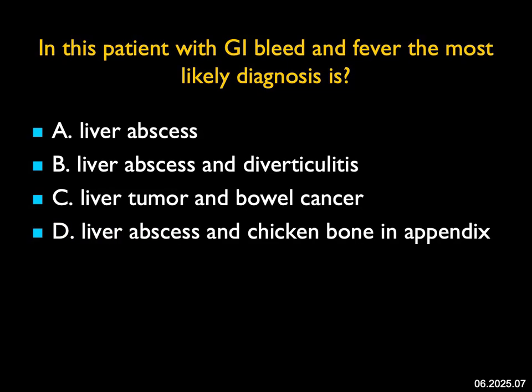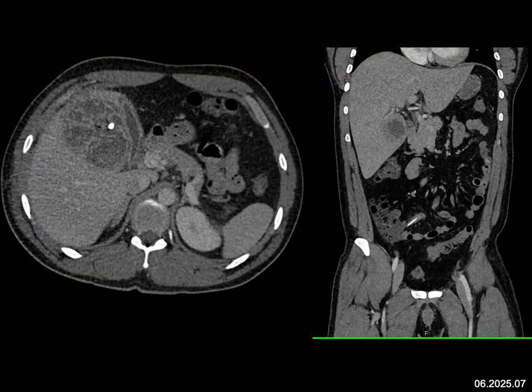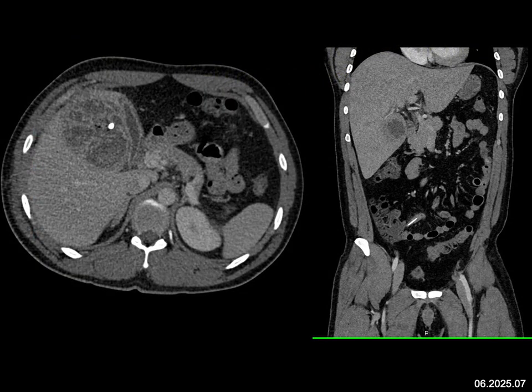In this patient with GI bleed and fever, I see a mass in the liver with a calcification. This could be an abscess or a tumor, and it pushes on the gallbladder. When you look down to the right lower quadrant, there's a linear structure — probably in the appendix. Liver abscess is a possibility. Remember, you can get a liver abscess secondary to diverticulitis, appendicitis, or any perforation or inflammation of the small bowel.